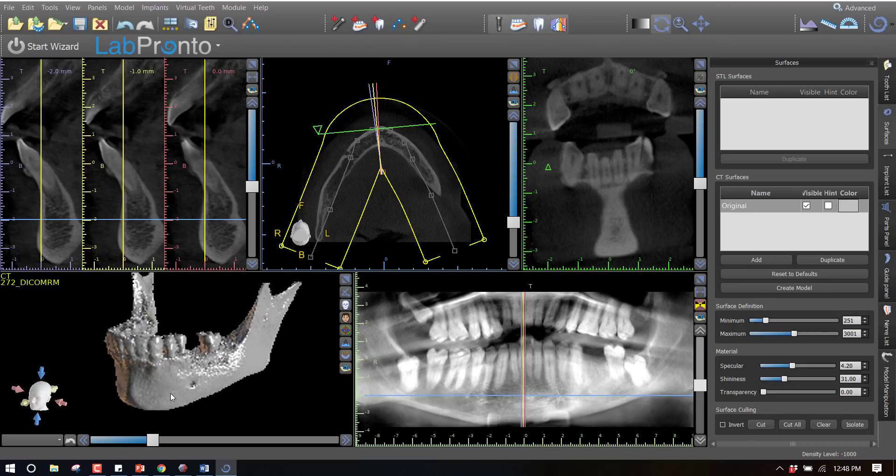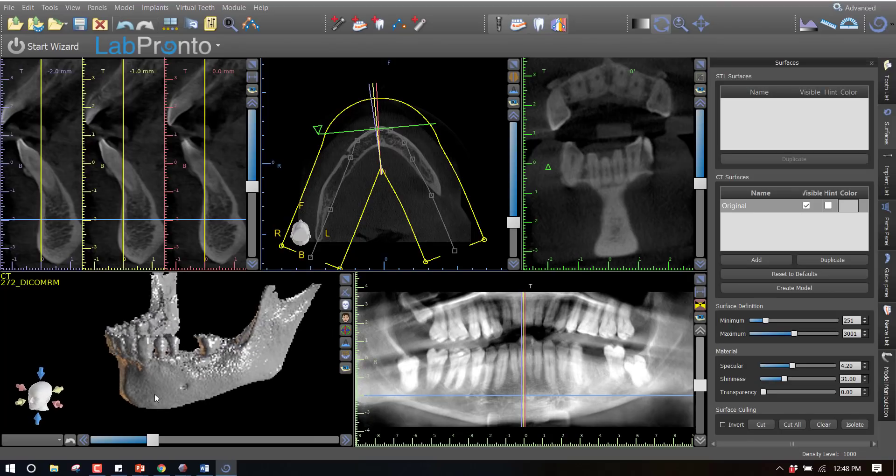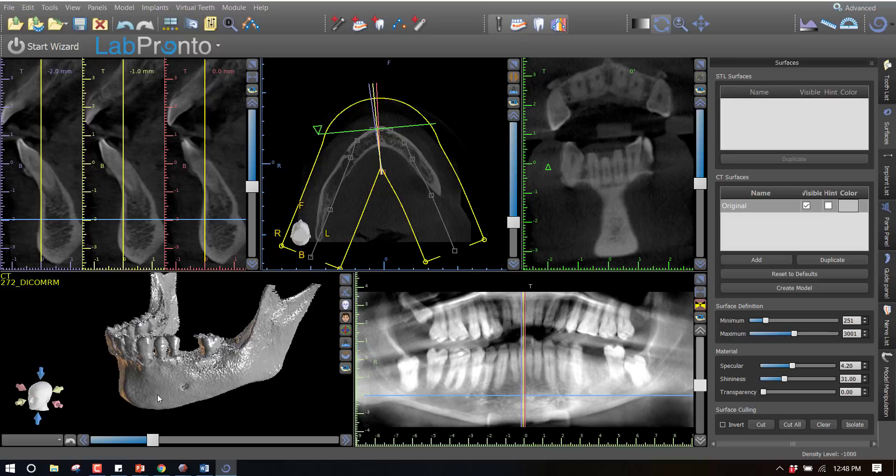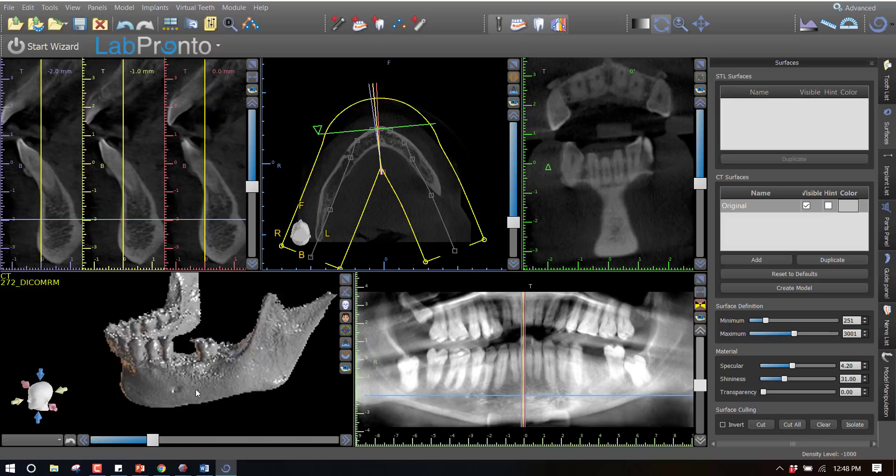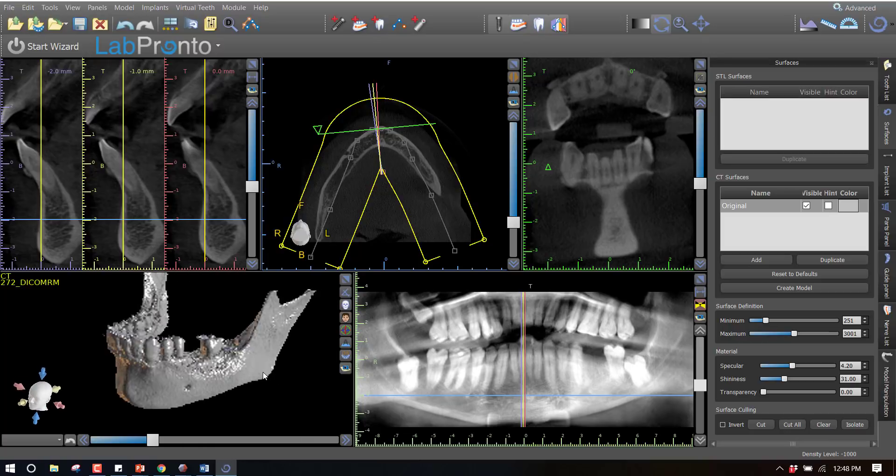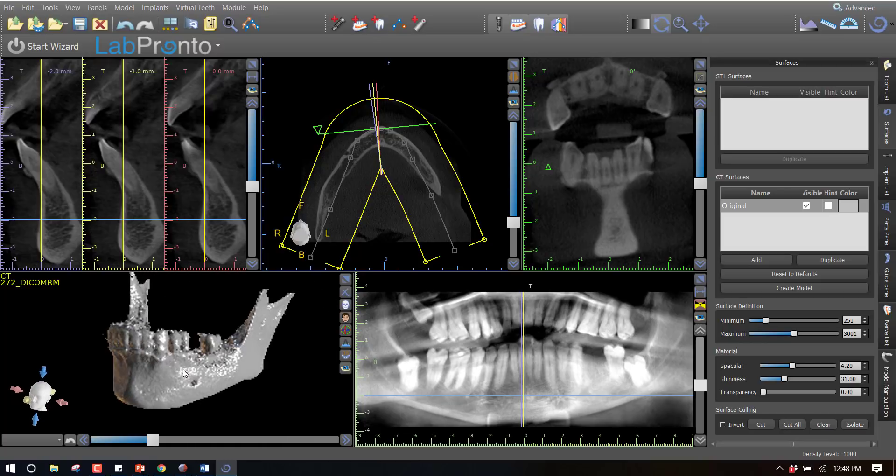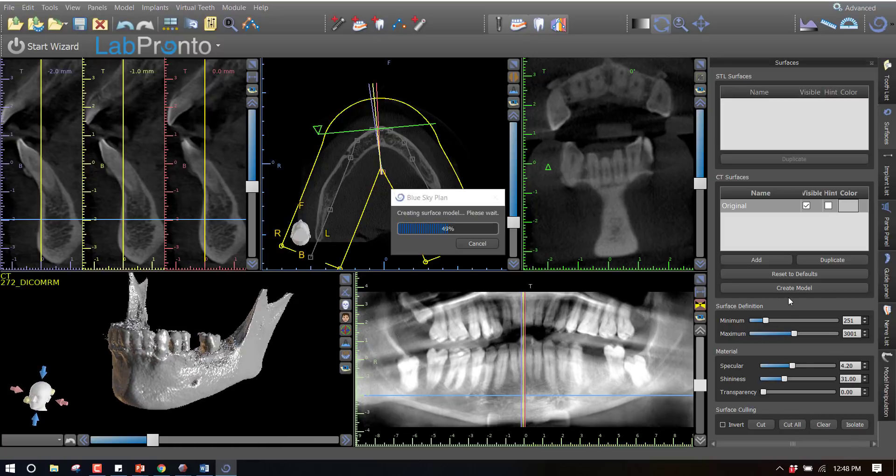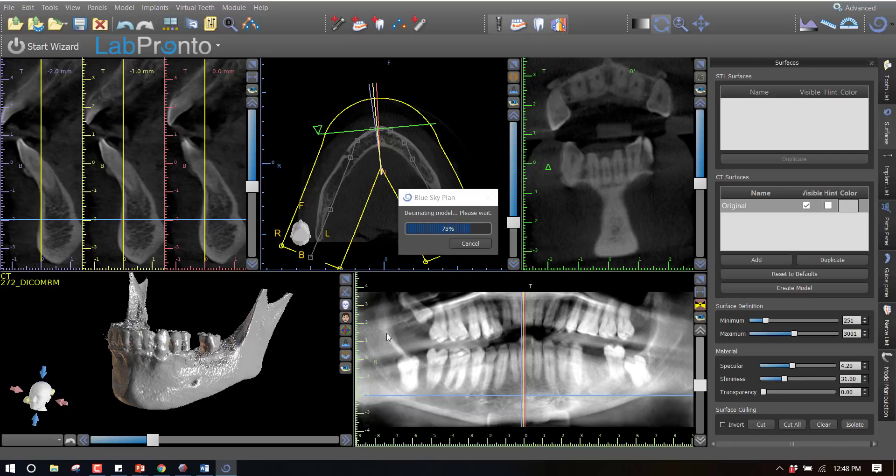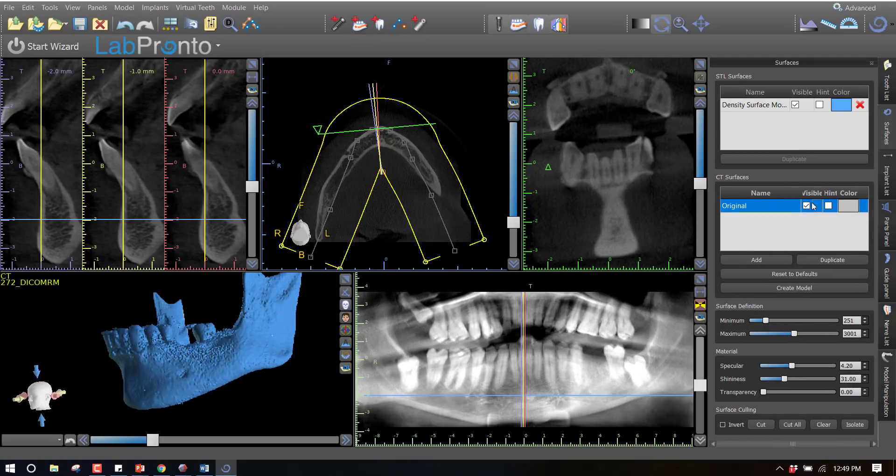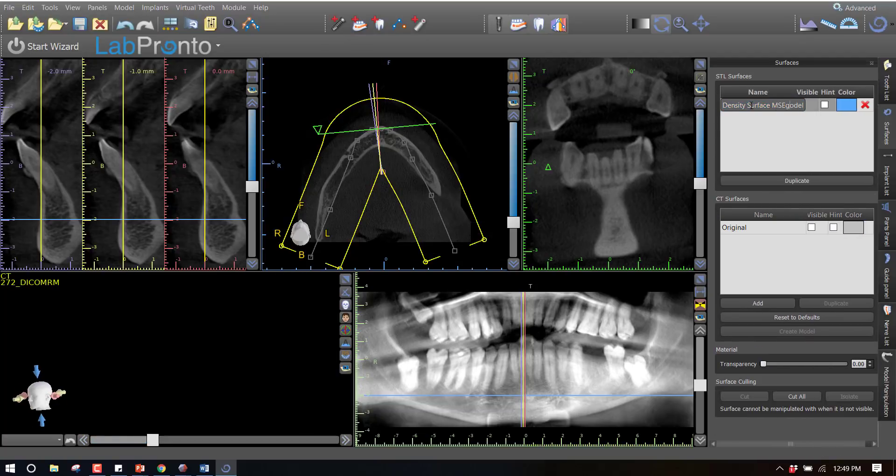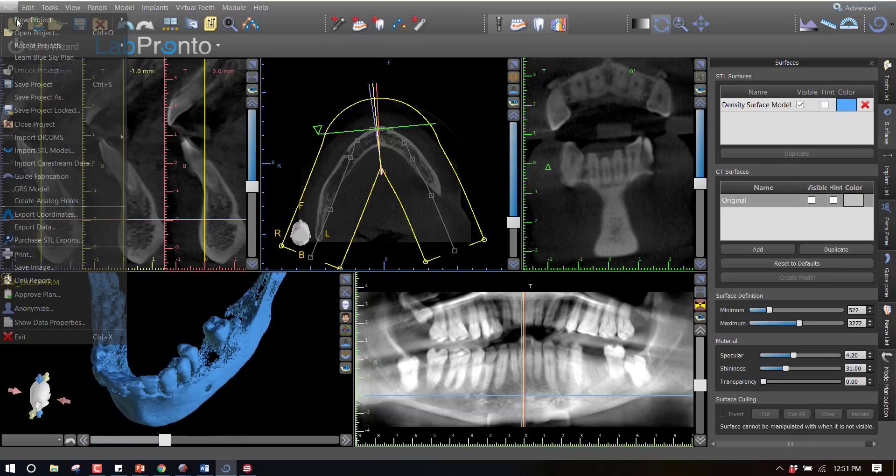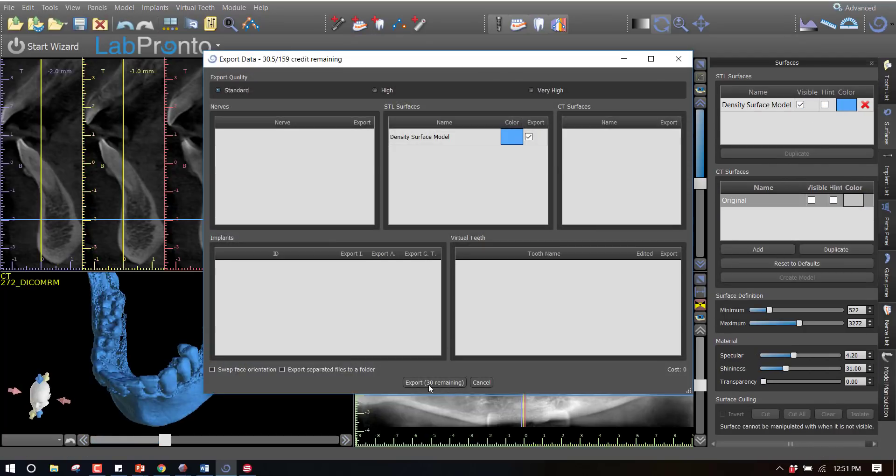Blue Sky Plan now enables users to export free of charge any surface in surgical guide mode other than a surgical guide. This might include segmented jaws that can be exported for 3D printing to do practice surgeries on.